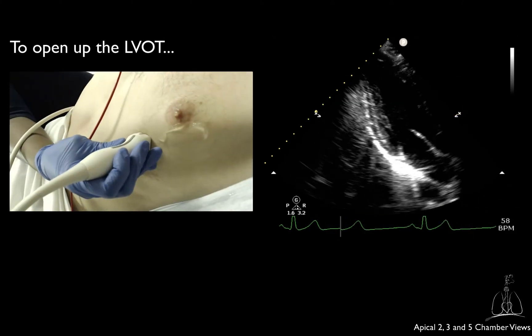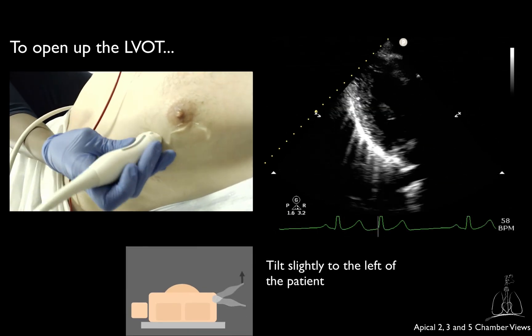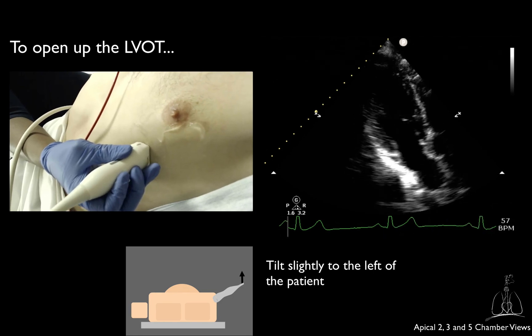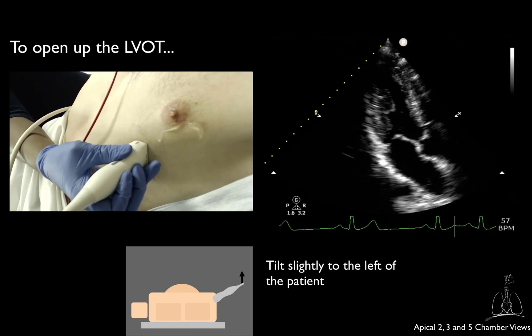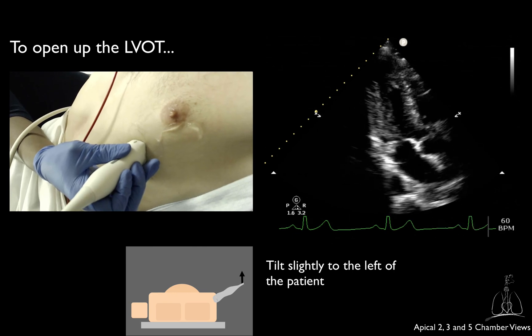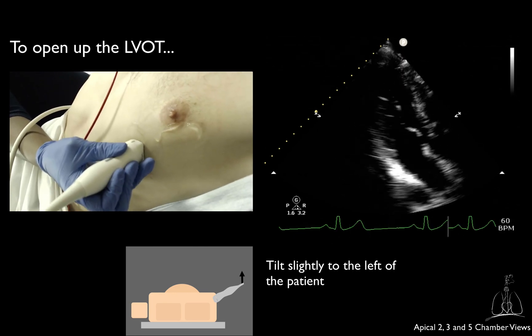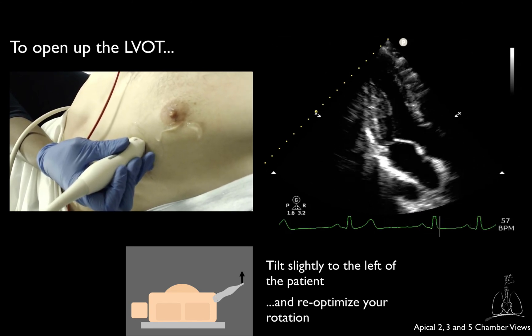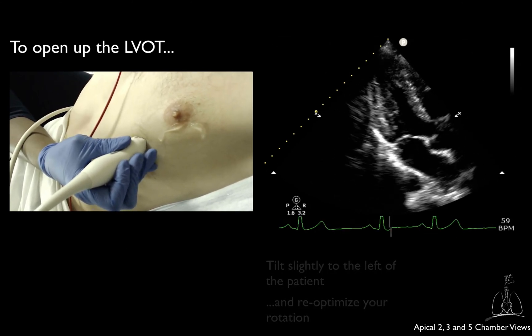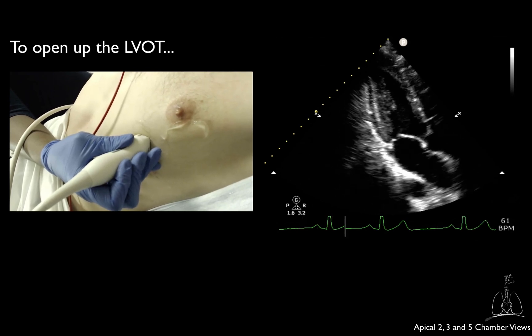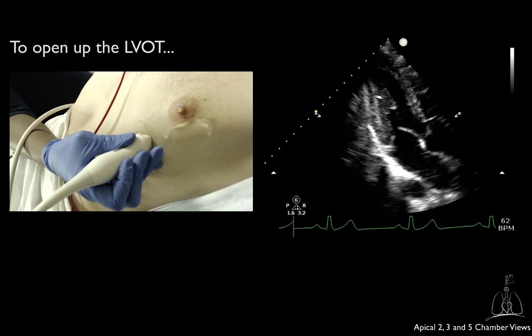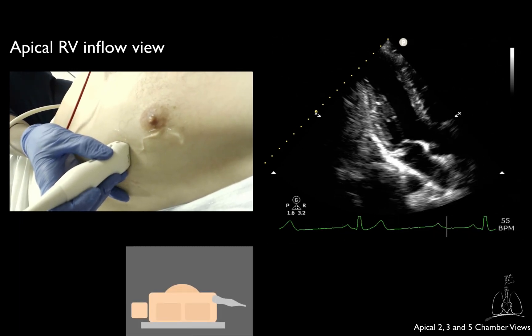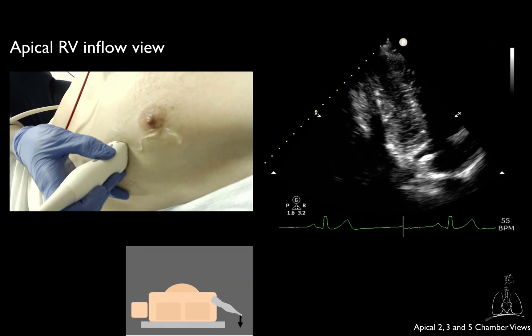You may have to tilt slightly towards the left of the patient to open up the left ventricular outflow tract. You may also have to re-optimize your rotation to open up the LVOT. If you tilt the ultrasound beam towards the patient's right, you will get the apical RV inflow view.